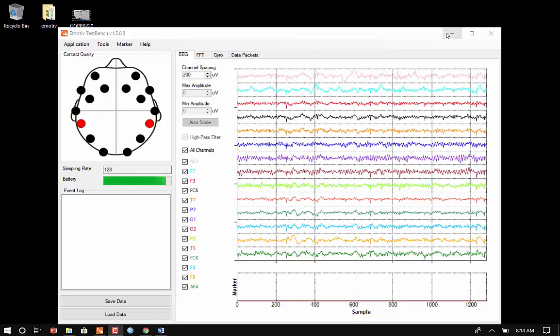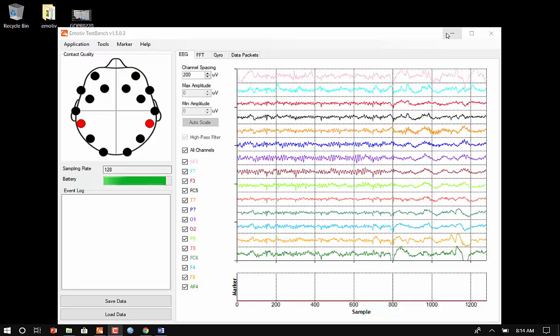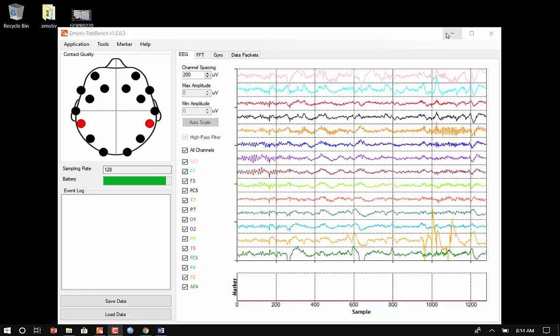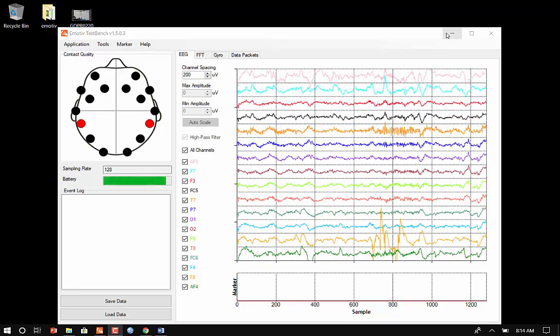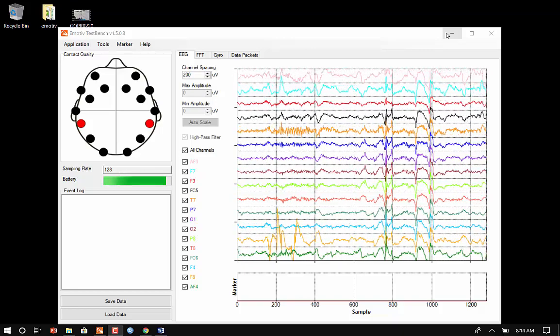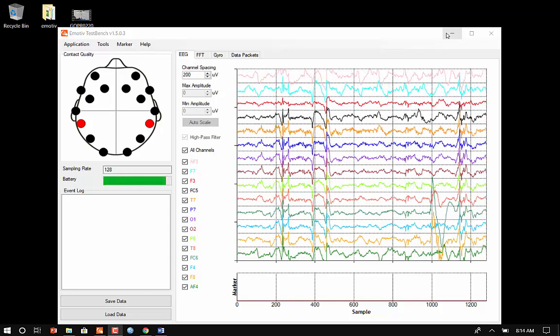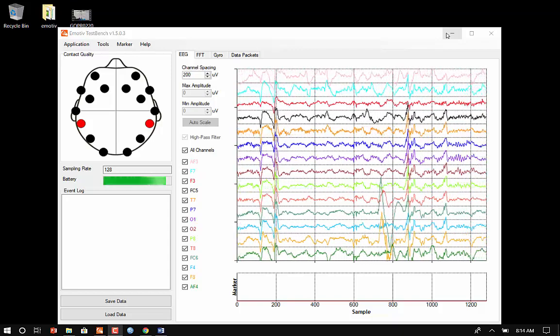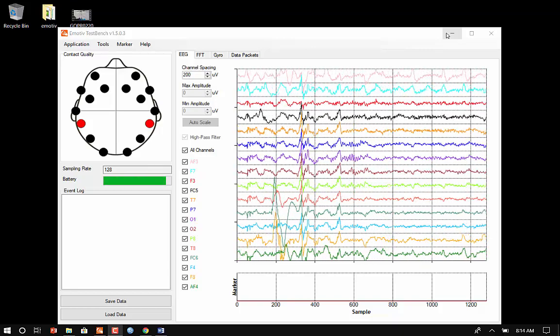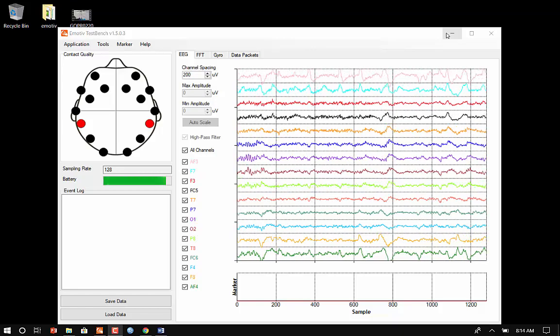Now, move your arms around. Watch what happens when he moves his arms around. Actually, it's not too bad. When he moves his head around, there we go. When he moves his head around and his neck muscles go, you get things like this. Those are actually muscle electricity. Your muscles use electricity as well. So the brain activity comes out of your brain, activates the nerves, and the nerves cause the muscle contractions.